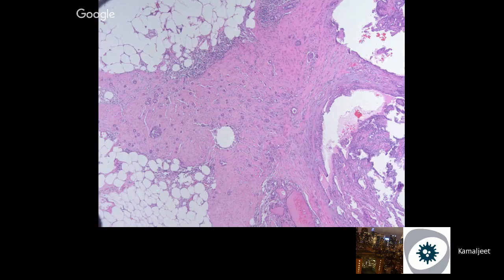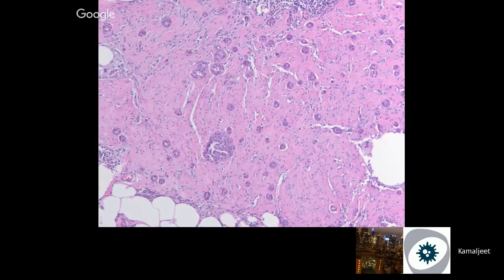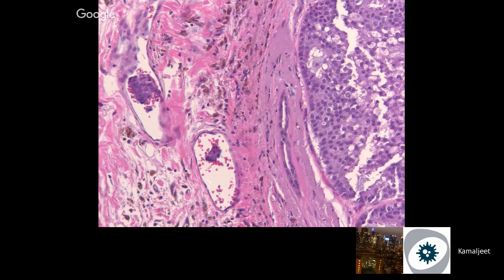Oops, sorry. So, high power picture. What makes them displaced epithelial cells? The morphological features. They're evenly dispersed, like a shotgun distribution, and they're rounded, pink, degenerated cells. You can see it in the biopsy tract all the way through.